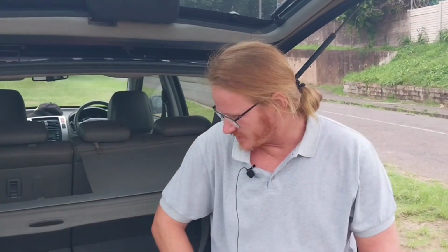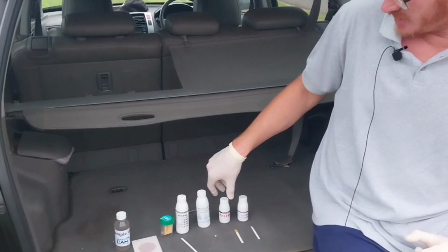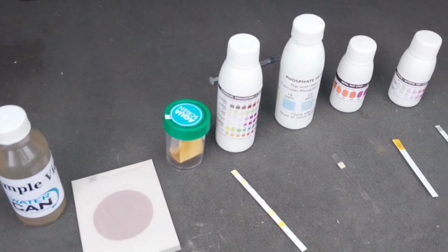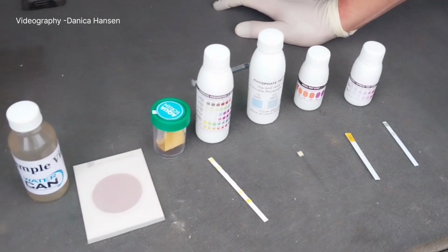We've got a number of tests that we're doing here. We're doing 2 bacterial tests, one for E. coli and one for coliform. Coliform is animal waste and plant waste that obviously is in water bodies. And then we're also going to do a series of chemical tests, which are, if you zoom in here, these little dipsticks here. Of course, they all give different parameters towards the quality and the health and the safety of water.